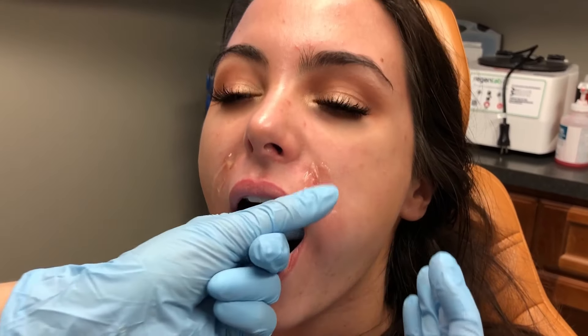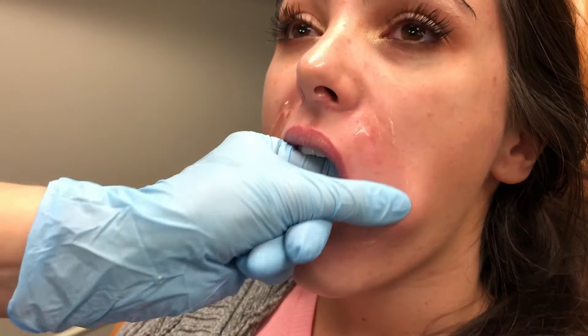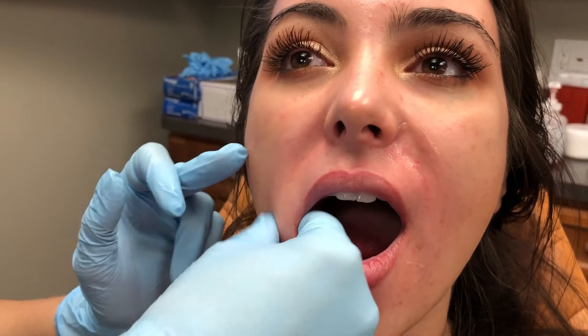I'm going to go ahead and smooth things out — I'm just going to use a little Arnica gel here. Have you open your mouth — I'm going in and checking the placement of my filler, feeling for any lumps or bumps. It feels good. I'm going to do her opposite side as well. This also helps with anti-bruising, and she can leave this on. It feels nice and smooth, and that is the end of Julia's treatment for her nasolabial folds.